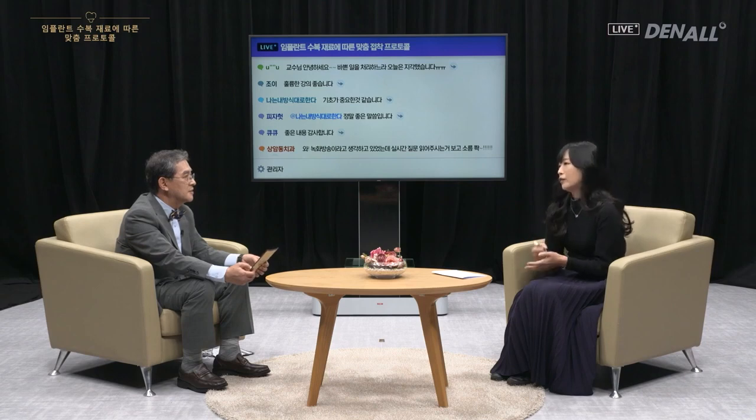By polymerization method, I'm thinking you're talking about the self-curing, light curing, and dual curing cement. There's no major difference in terms of polymerization method. By vendor, depending on how it is made, cementation differences are shown. Rather than polymerization method, there are ways to increase the cementation strength by increasing polymerization rate.